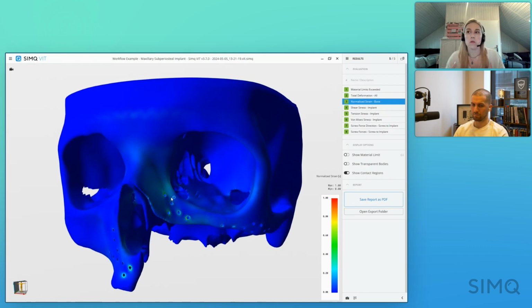Because medically, when a bone takes too much force or not enough force, you can have bone growth or bone wasting. If the pressure is not enough on a bone, just like if you don't do weight training exercises, you can lose bone that way. So it's very important how these pressures are placed, not only with the implant design, but on the bone.